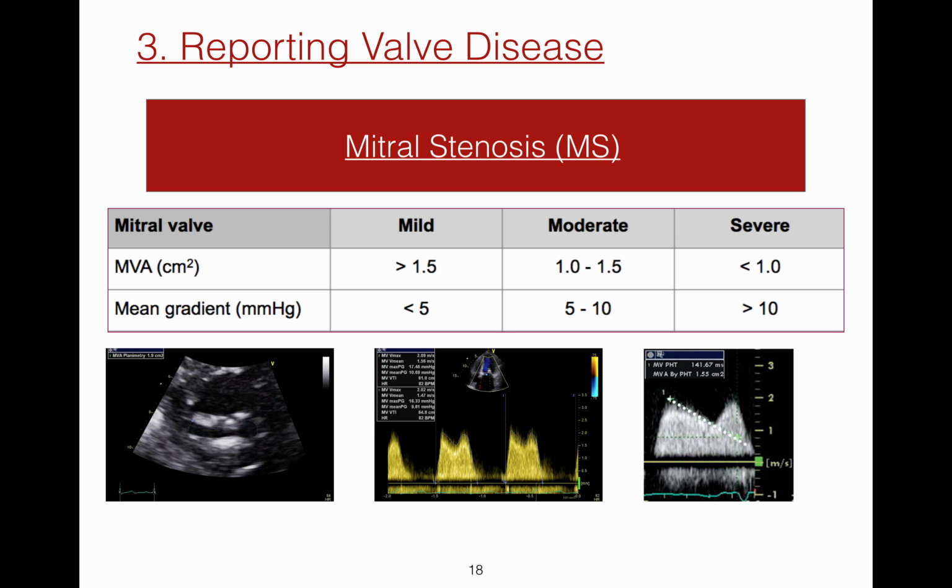Mitral stenosis is not as common as aortic stenosis. Nonetheless, as necessary, you should now be able to provide an evaluation of mitral stenosis. The mean gradient and pressure half-time measurements are the most straightforward and reproducible ways of evaluating mitral stenosis that you are now familiar with.